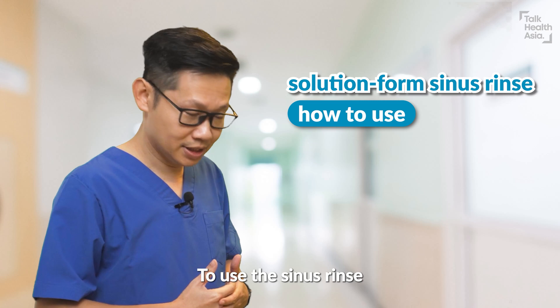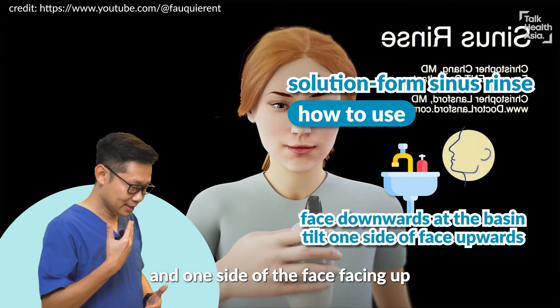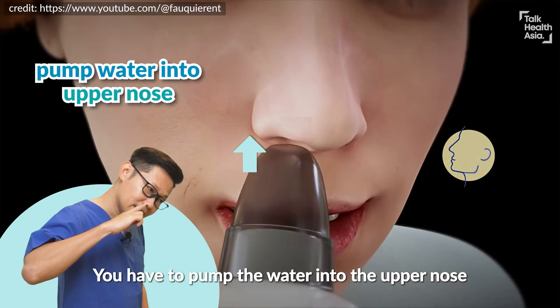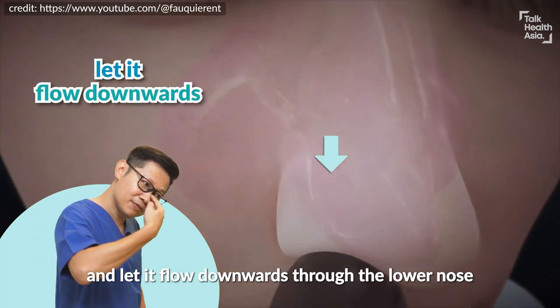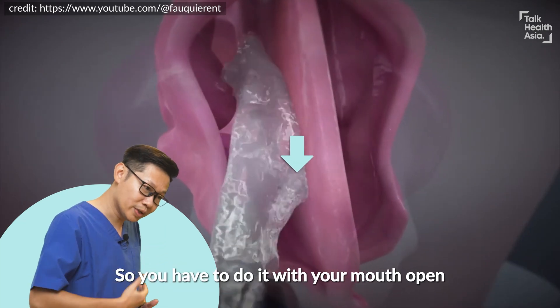To use the sinus rinse, you have to be at the basin with your face facing downward and one side of the face up. You have to pump the water into the upper nose and let it flow down through the lower nose or come out through the mouth. You have to do it with your mouth open.